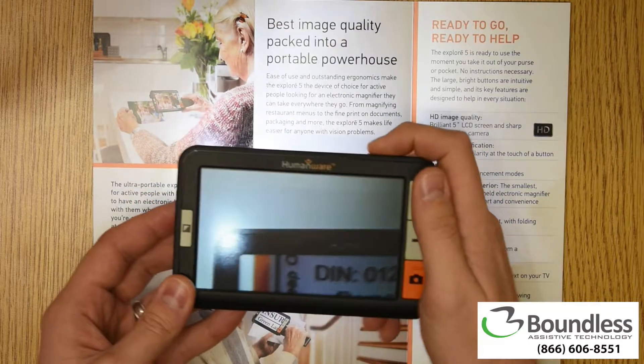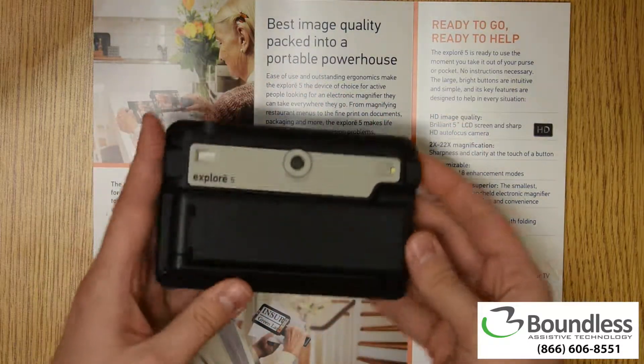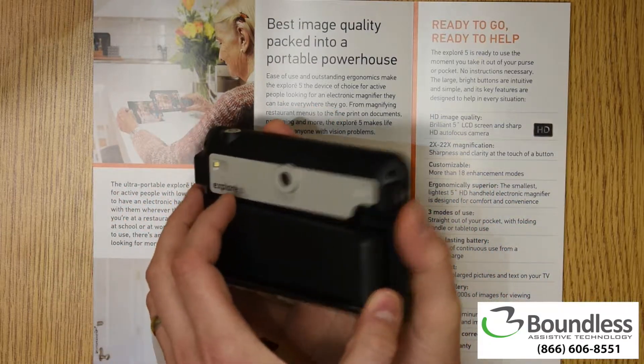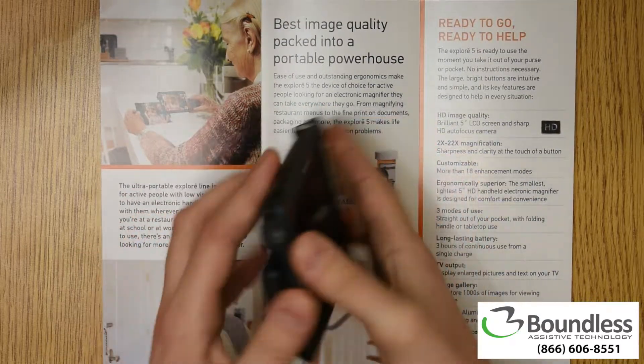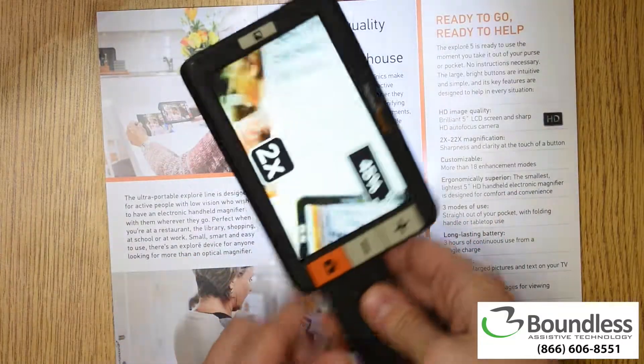Now, this device has a handle. I'm going to go ahead and turn the screen off so we don't blind the camera. Behind it, we have the handle — it actually folds out. So it's nice and compact while you're using it without the handle, but if you want it, it folds out like this.